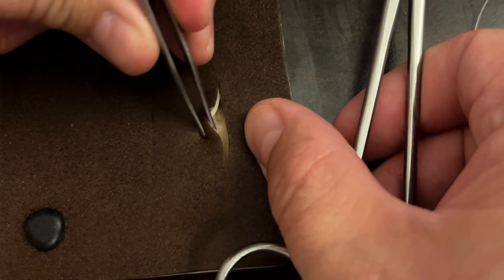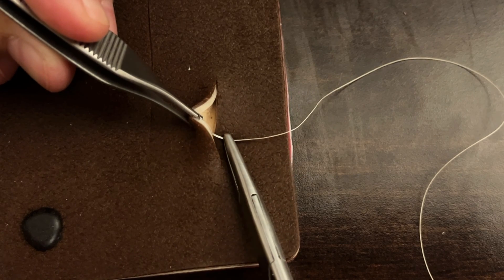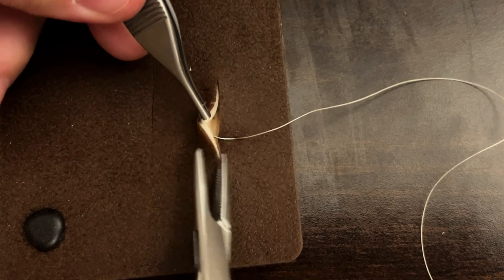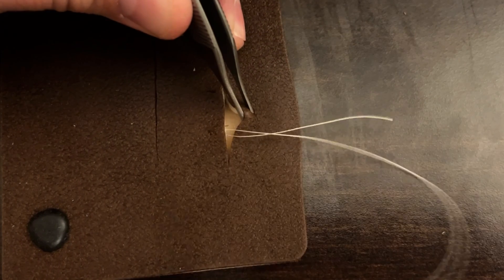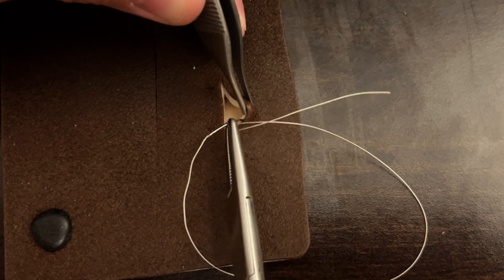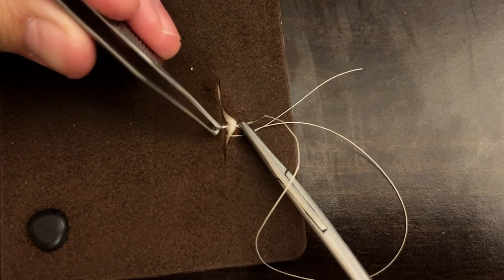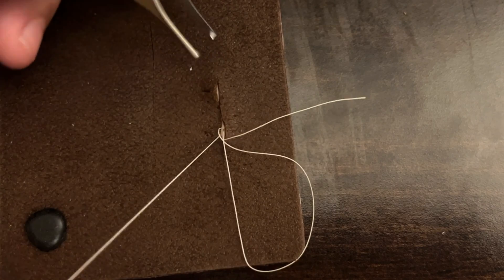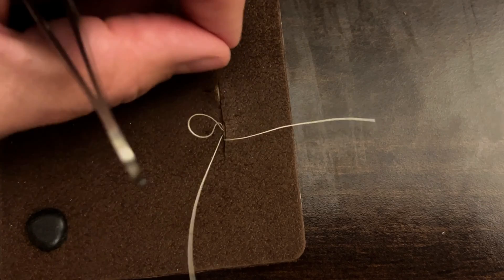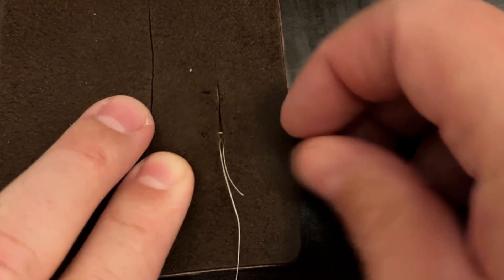Down here below, I'm going to open this up, grab it with my forcep, start deep, go superficial, and exit in the dermis just deep to the epidermis. Let go, grab with my needle driver, and reload — see how you can do it in one quick movement. Then across on the other side, enter the dermis and go deep into the subcutaneous tissue, keeping my passes through the tissue at the same depth on either side. Pull this through making sure that my tails are on the same side of the loop.